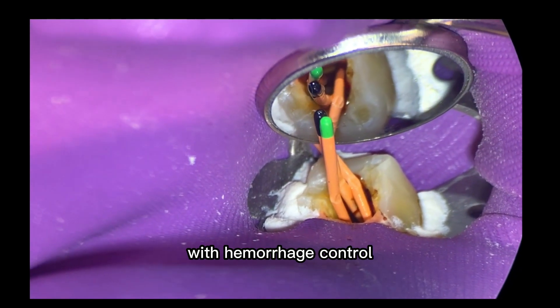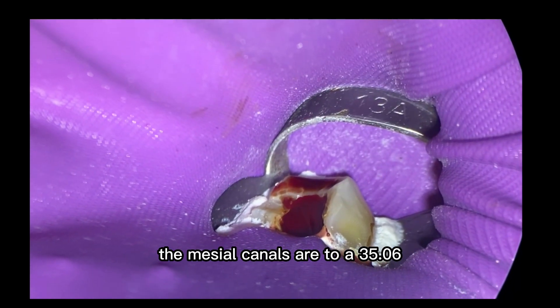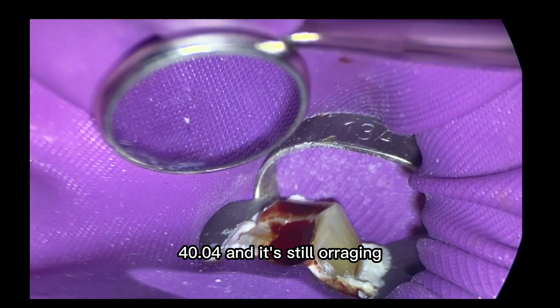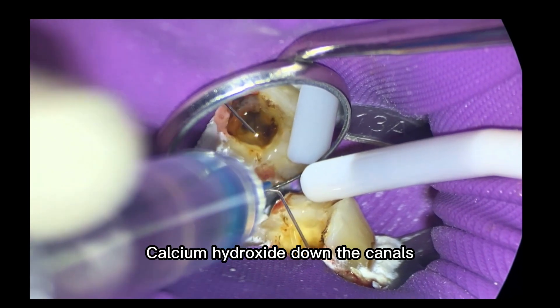We're having a little bit of a tough time with hemorrhage control. Later on in the video, we're going to come back two weeks later and see what the pulp looks like. We've cleaned and shaped everything. The mesial canals are to a 35-06, the distal canal to a 40-04, and it's still hemorrhaging. We didn't finish the case — we placed calcium hydroxide down the canals.